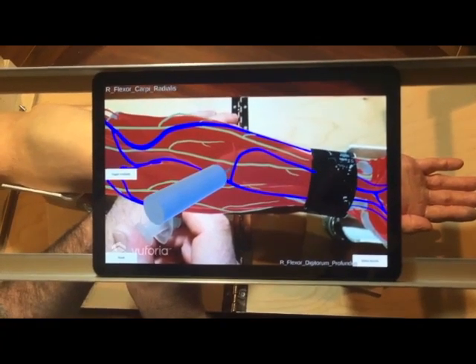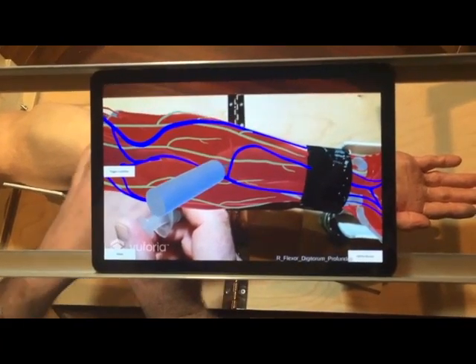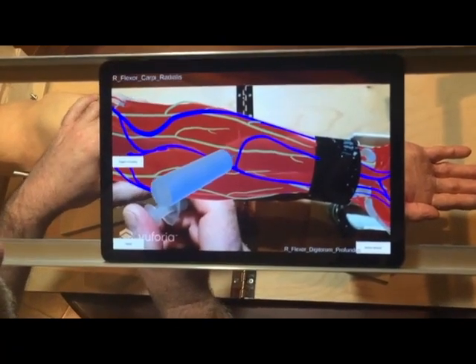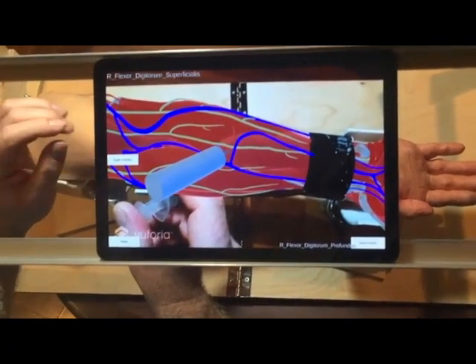There will be some light background EMG present when the needle penetrates any muscle. The arm can be rotated and the augmented reality anatomy will move with the physical arm.